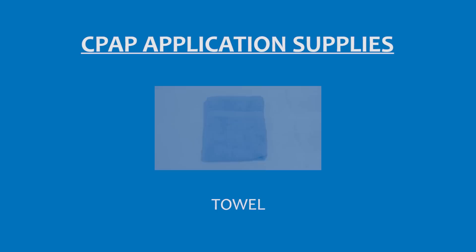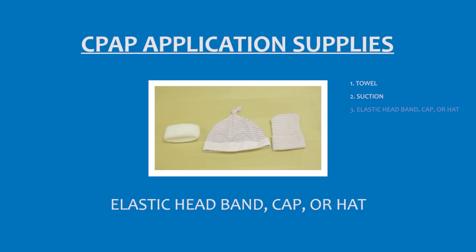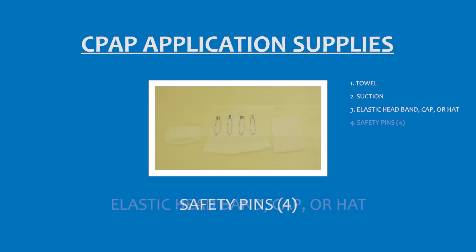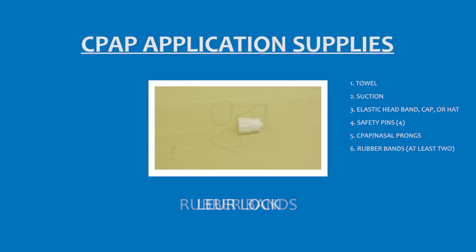For CPAP application, you'll need a towel to help position the patient, suction to clear the airway, either an elastic headband, cap, or hat to apply to the patient's head, 4 safety pins, the CPAP prongs, at least 2 rubber bands, and a lure lock to go on the CPAP prongs.